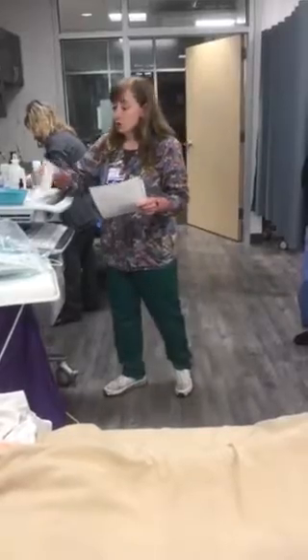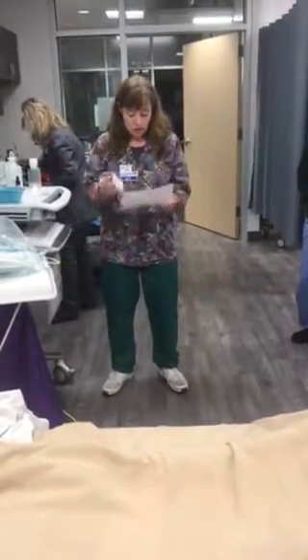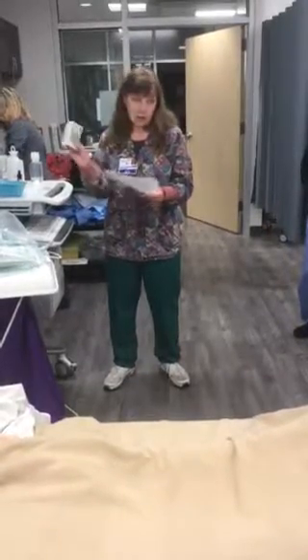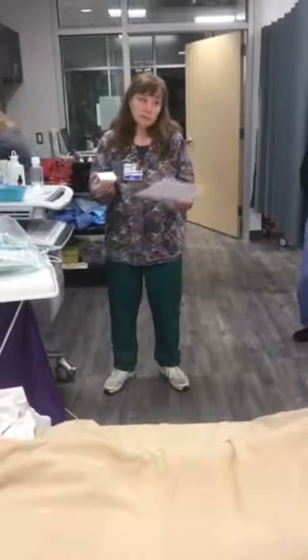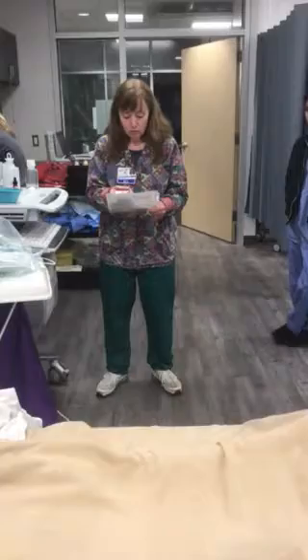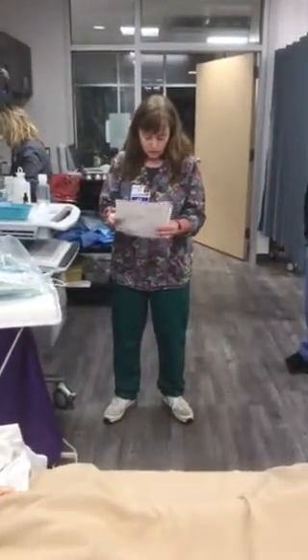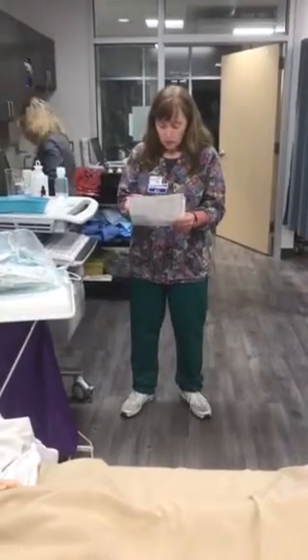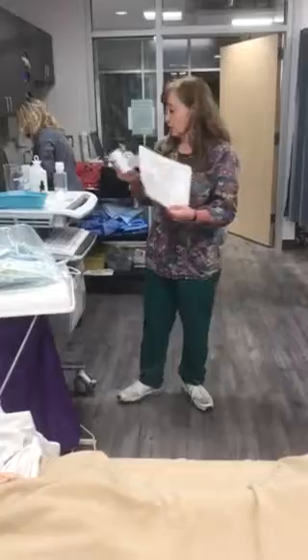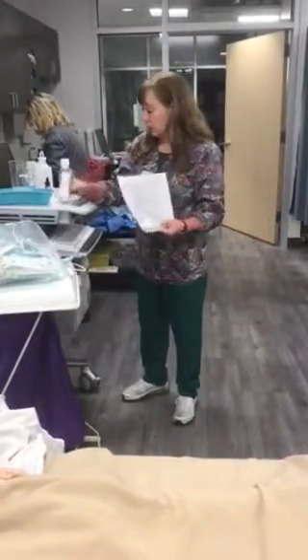So what we're going to do is our first med check. We're outside the room, doing our first med check. So we have metatarsal, and we'll pretend like the name is on here. It will come up from the kitchen with it on. So metatarsal, 6/21/1988, no known allergies. This is Javity. I have to look for the Javity order. Javity 150 milliliter bolus. It's a 1.5 kilocal is what we're getting. Normally that will also be on your order as well. And we're going to make sure it's not expired and hasn't been contaminated at all.